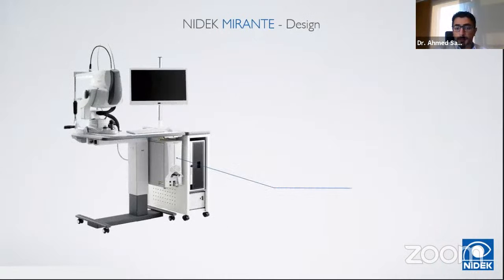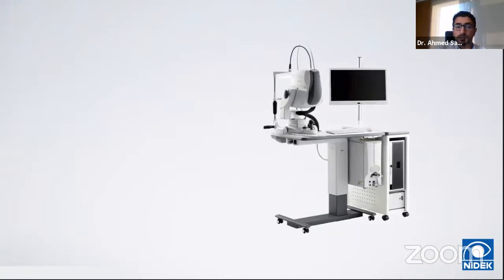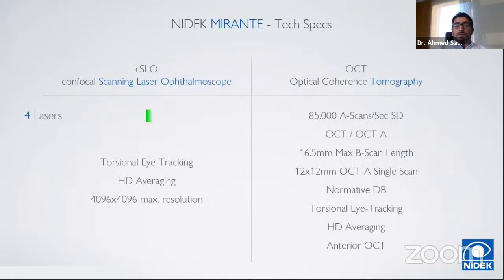This is a laser control box, and it includes 4 different laser cavities, which we use to capture different imaging modalities. And of course, this is a table. This is our server and the PC isolation transformer, and this is the device in general.